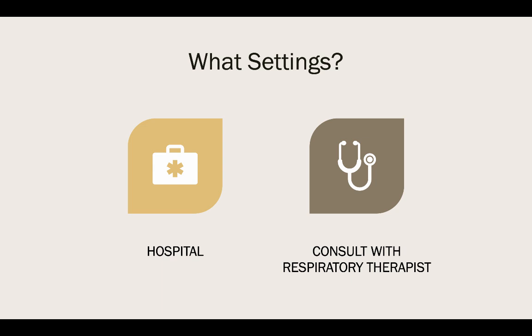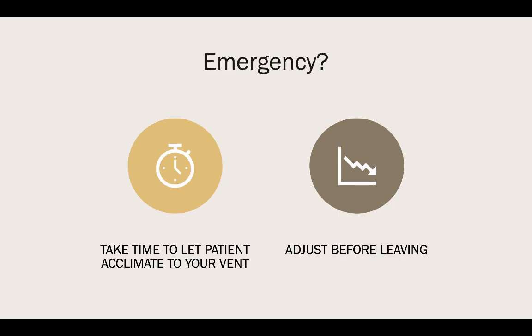Talk to the respiratory therapist. Talk to that patient's respiratory therapist. What are the settings there? Are they working for that patient there? They probably are. They've probably dialed it in for that patient. So you know what? We're going to go with those. Those are going to be our initial settings. They're going to be our hospital settings.